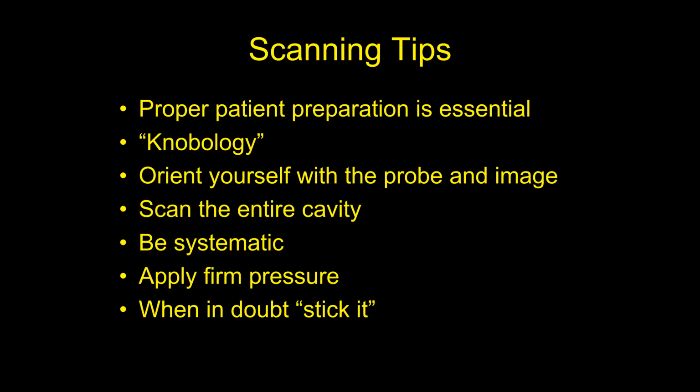It's got too much gas around it. No matter what you do, you're going to get a crappy image if you try to ultrasound an animal through hair, through fur. Okay. So you need to clip the hair on the belly like you're going to spay the animal. Like you're going to really go down to the skin, you need to clip the hair. Okay. And you're going to get some owners that don't want you to do that.